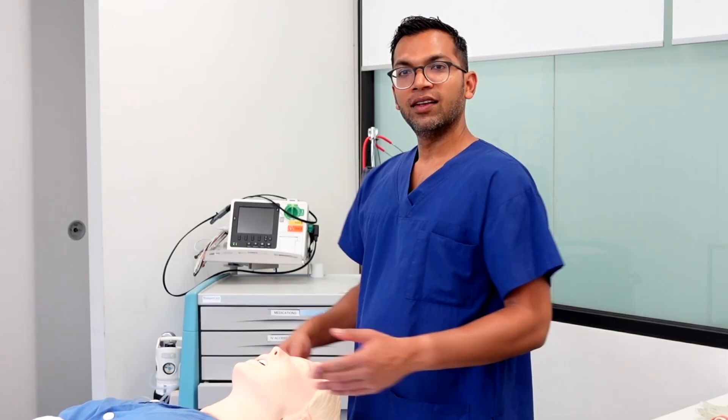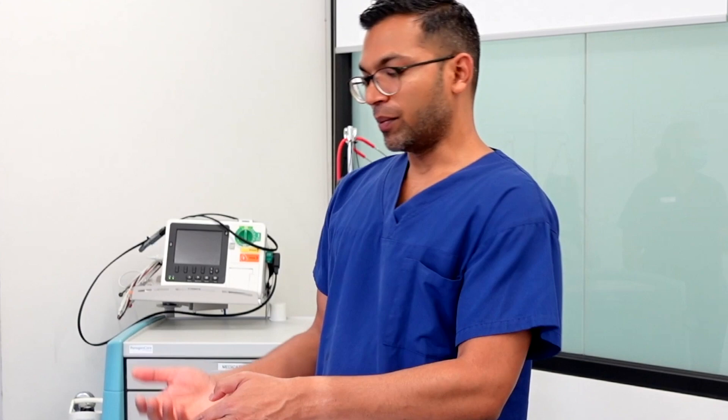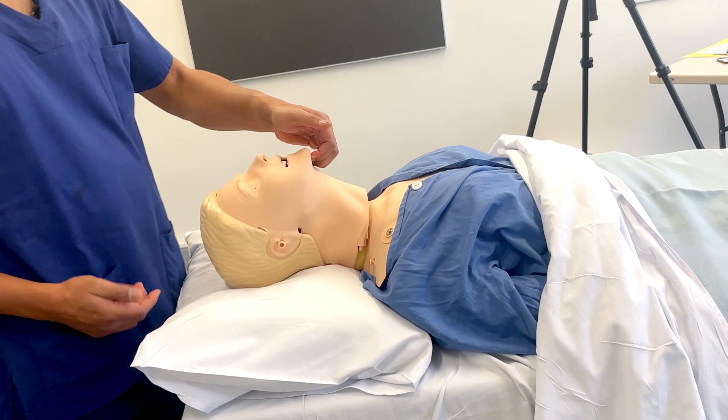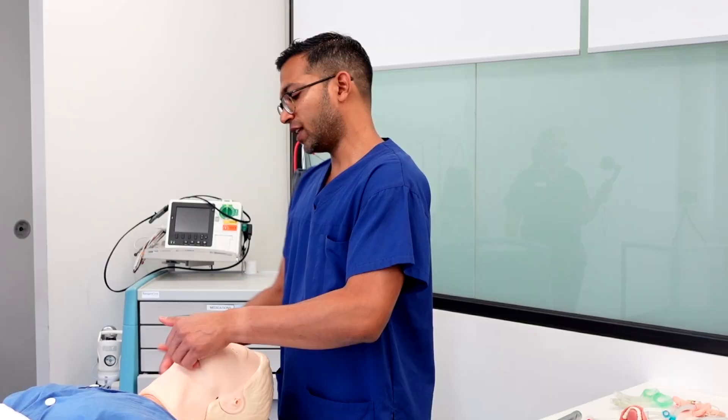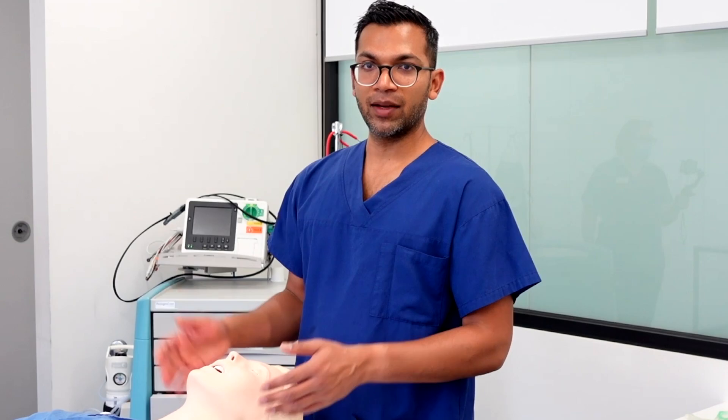The final maneuver is the chin lift — placing your fingers just at the chin or mental prominence and lifting up. To me, it works as a combination with the jaw thrust: I do the jaw thrust and then hold it in place with the chin lift. The chin lift is the more active hold, making it much easier to maintain. So those are the three maneuvers — jaw thrust, head tilt, and chin lift — which are really useful even for an obstructed patient on the ward.